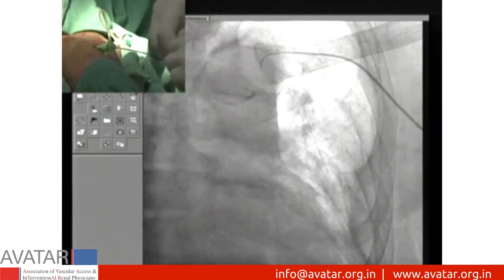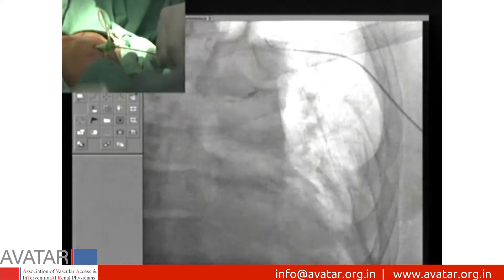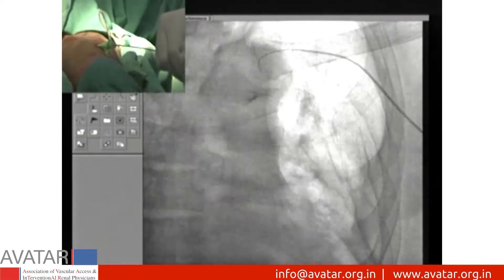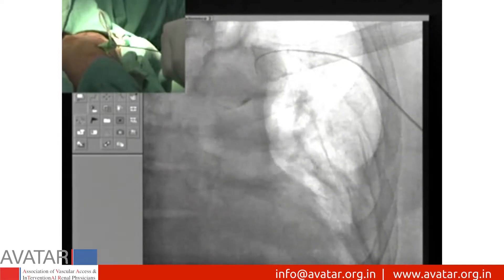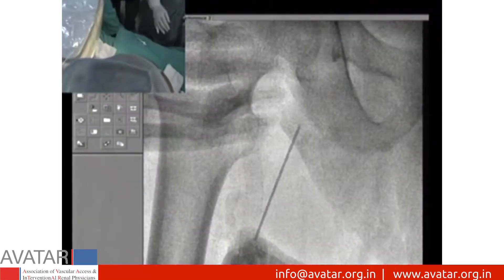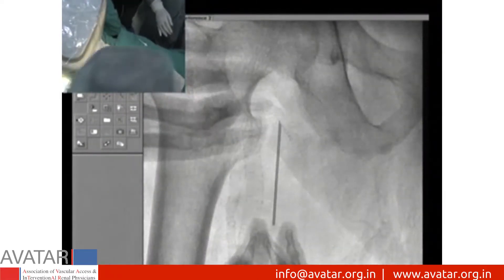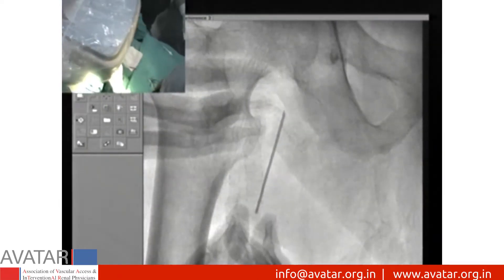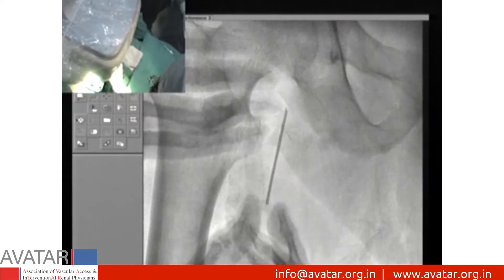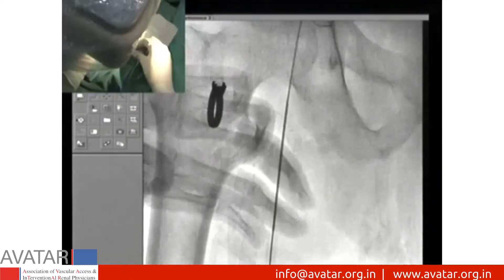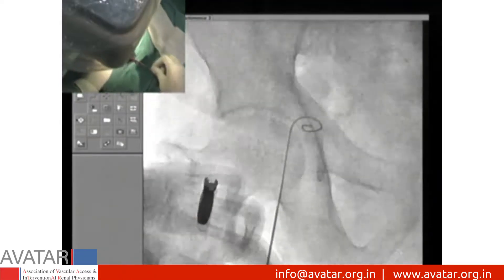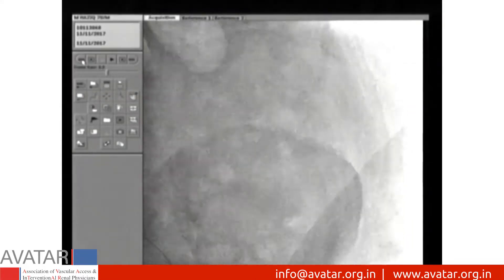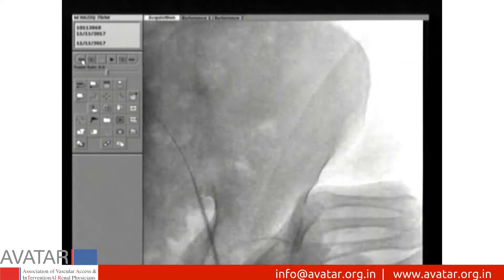A 0.035 wire is used to cross the lesion but could not be negotiated. We decided to go through the femoral route. A femoral venous puncture is done and efforts are made to cross the lesion.